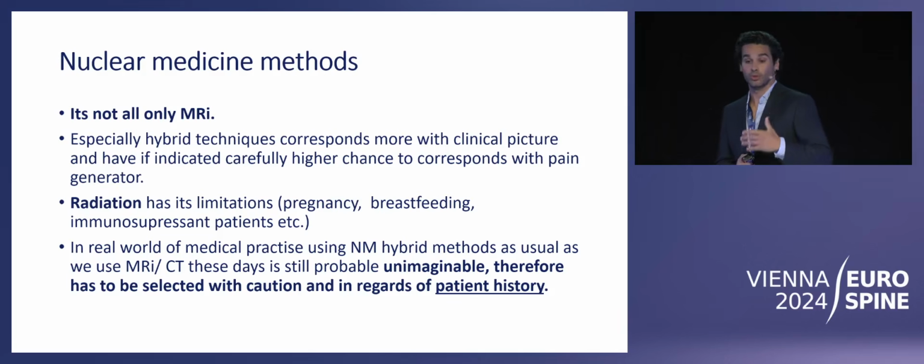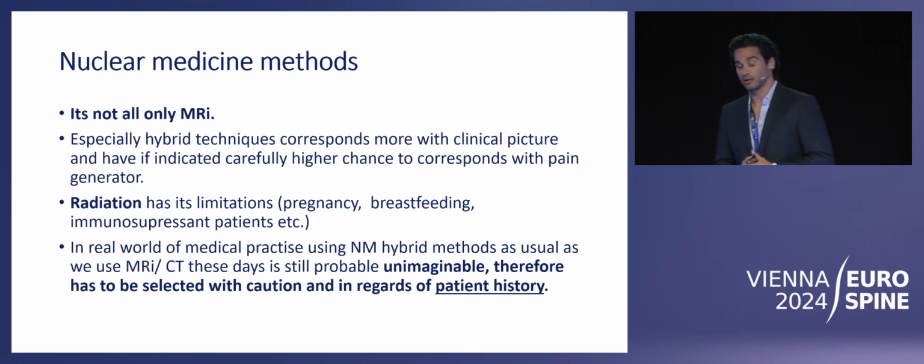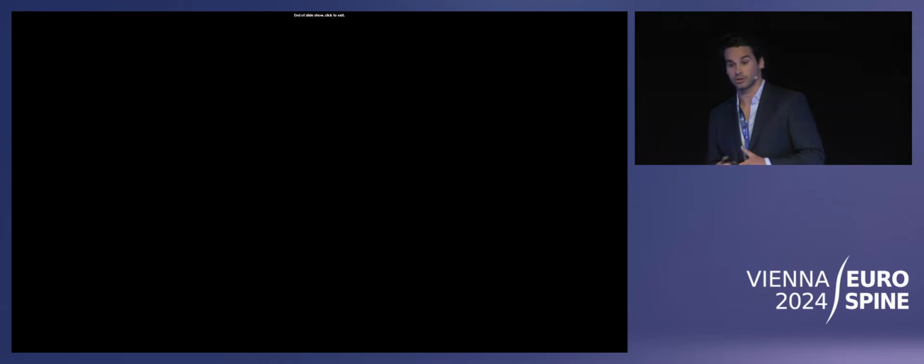as usual, we do use MRI or CT. These days it is probably a little bit unimaginable in clinical practice, at least in Prague, in terms of availability. Therefore, they have to be selected with caution and with regard to patient history.